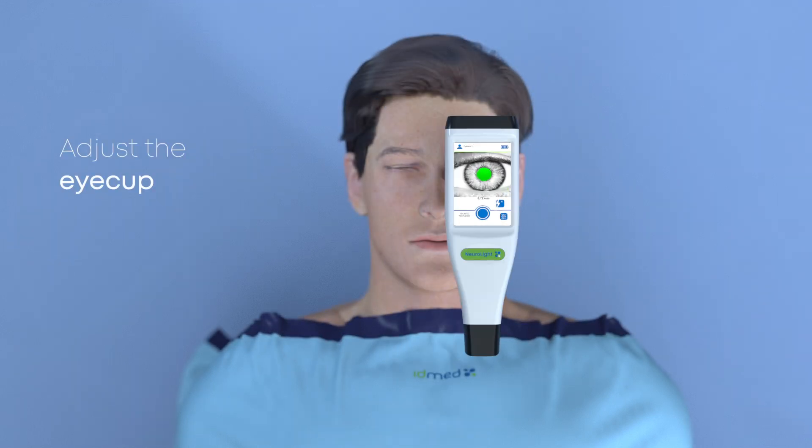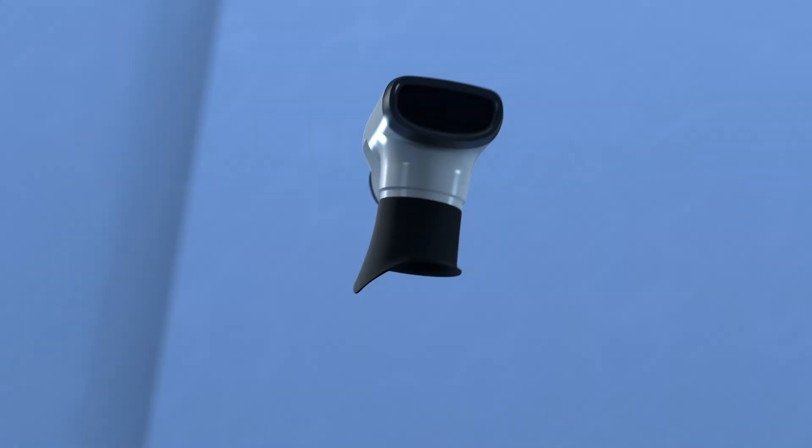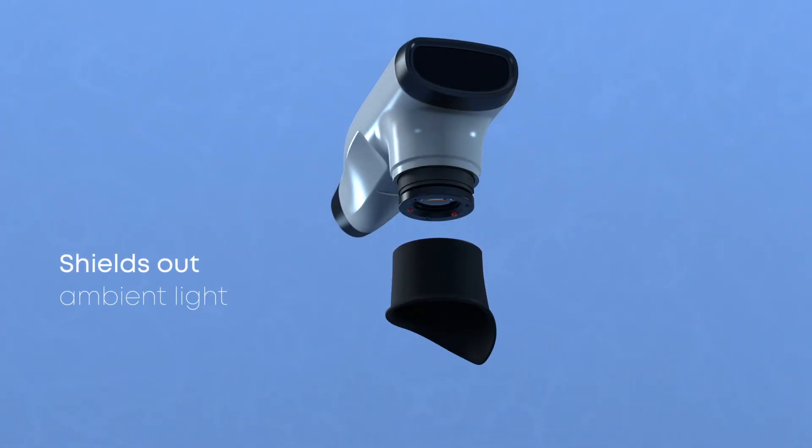Just adjust the eye cup — you can measure both eyes to monitor anisocoria. NeuroLight is very light in weight, and the eye cups are reusable and block out ambient light.